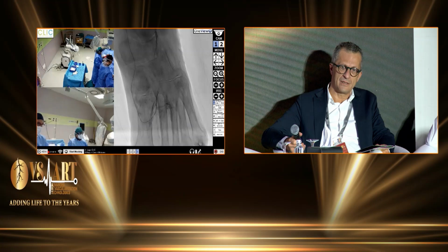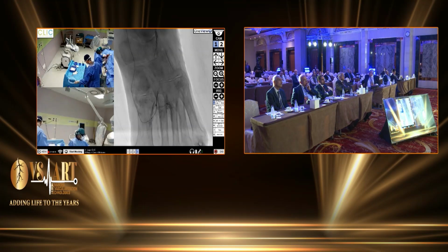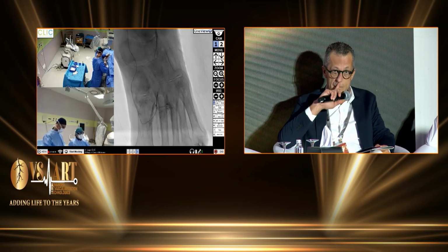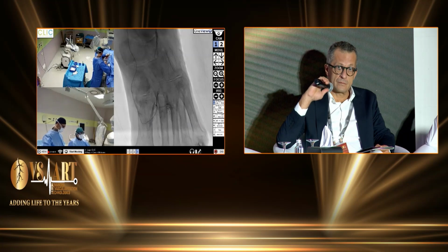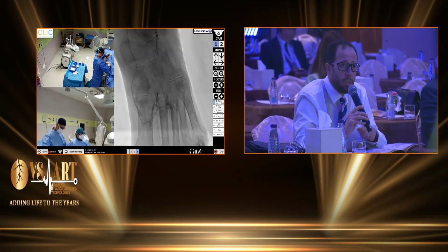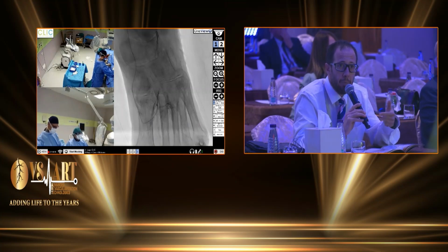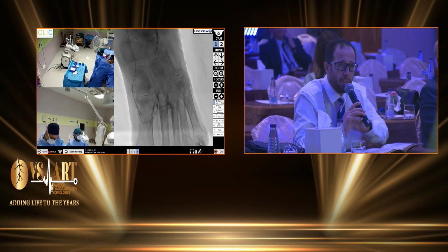My question is about the consequence of the use of drug-eluting balloon below the knee. Do you have any experience with the slow flow phenomena? It is something that maybe not to you that are expert, but worldwide, people are worried about using drugs below the knee for this reason. Do you think it's justified? And do you think that new generation of balloons, maybe with other drugs, will change this phenomena? Thank you.